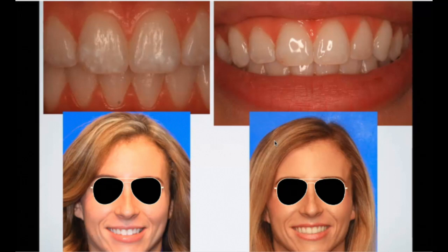Also worth noting, because it's an unfilled resin, all right, what happens when you shine a light on it? Curing light. Besides it cures. What's that? Yeah, it shrinks significantly. Like a lot more than you would expect, right? So even our packable composites and our highly filled composites, there's some level of shrinkage, right? And so that's why we cure in layers. That's why we do all the things that we're supposed to do with composite to minimize the effect of the shrinkage. Now, when there's zero fill at all, you have an exaggerated amount of shrinkage.